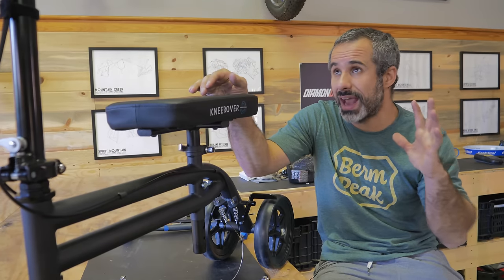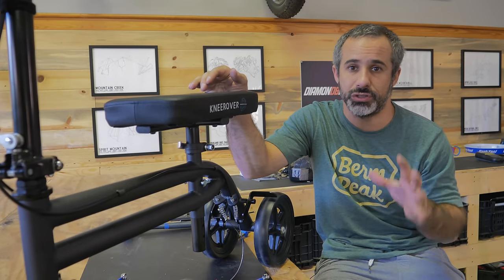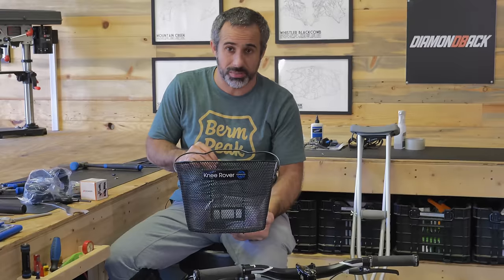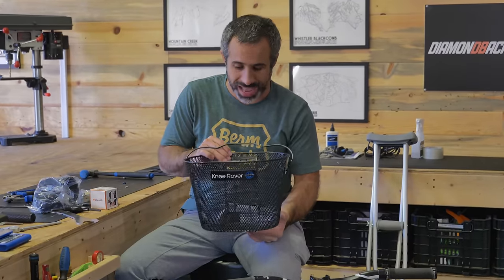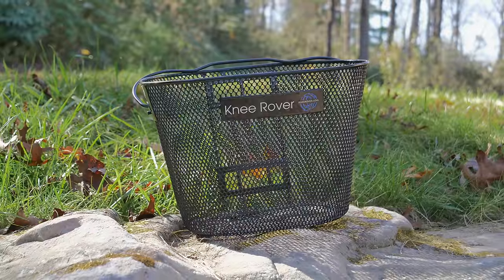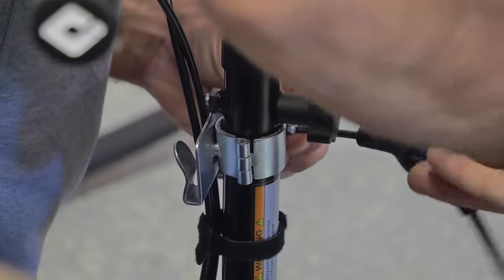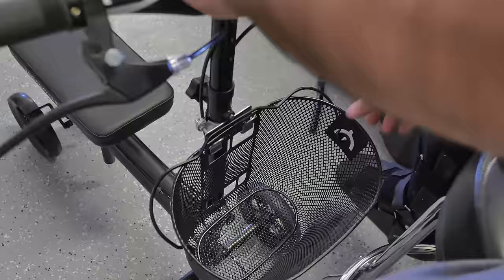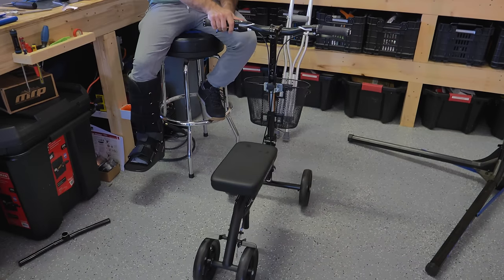Now we have to start adding the things that are going to make this more functional for me to get around the house and do my job. This is a knee rover brand basket. I was probably on all sorts of painkillers when I ordered this because I could have ordered any basket — it didn't have to come from the knee rover dealership. Obviously they wreck you at the knee rover dealership. Okay, goes on here, nice and snug, got a low center of gravity. This ain't bad — I can carry stuff around.